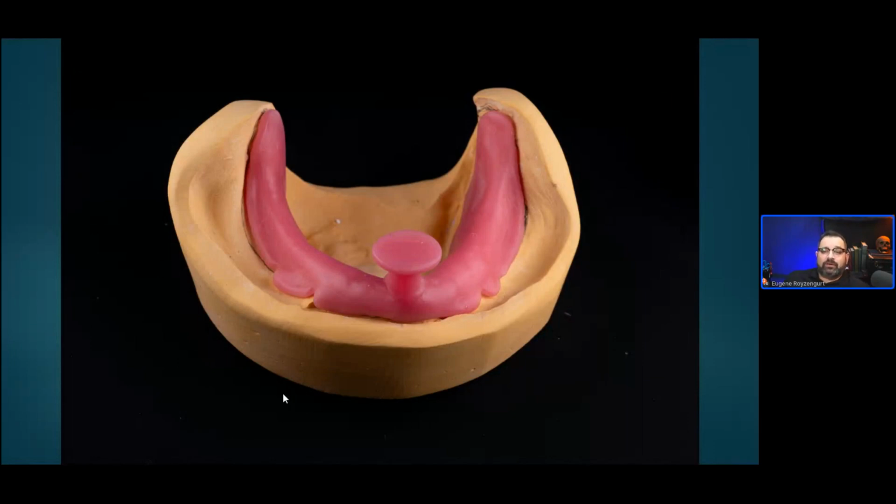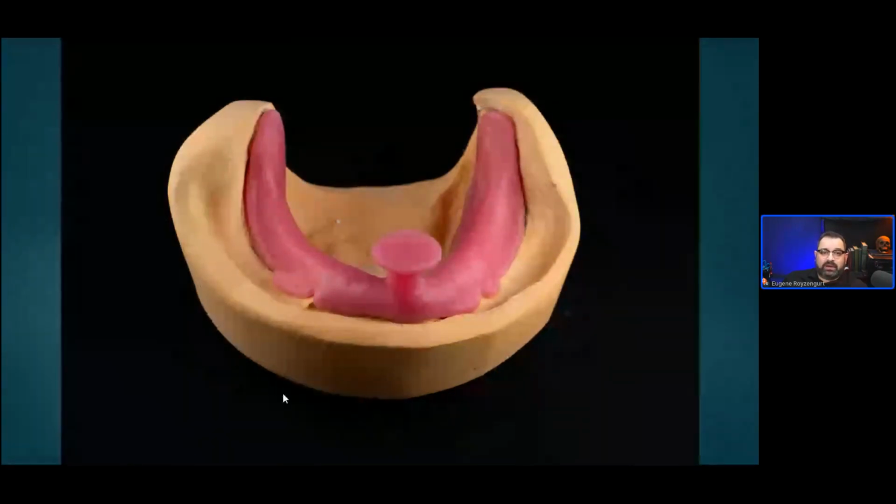I'm a big fan of close fitting impression technique. So minimal impression gap on things. So I can just block out the undercuts in 3Shape, or if you want to use something else, at 3 degrees, and then make sure my tray fits nice and uniform. And I don't even have to board them half the time. Just take a nice wash impression and get a really good adaptation of the tray and go from there.